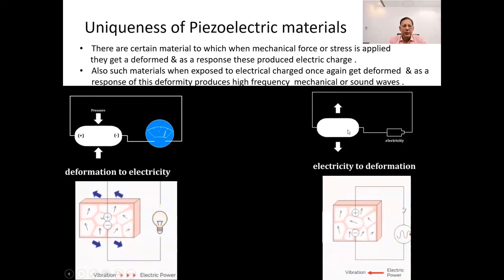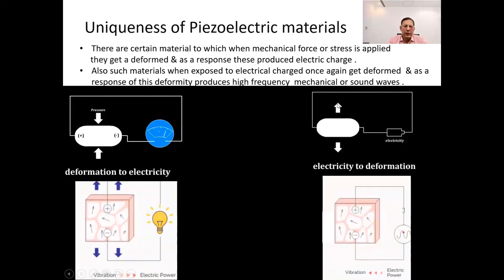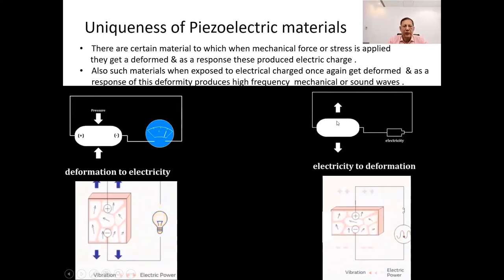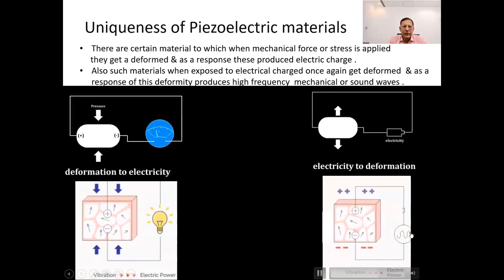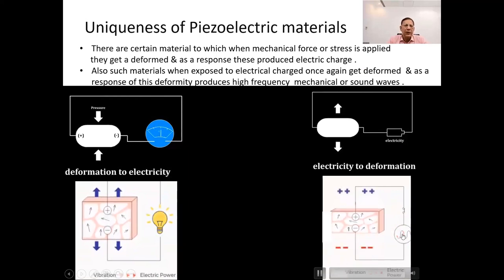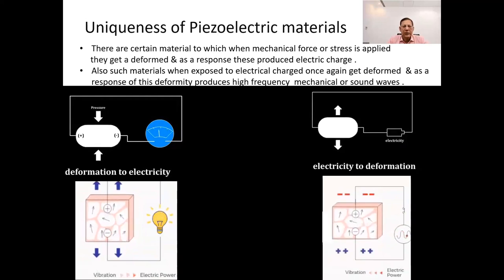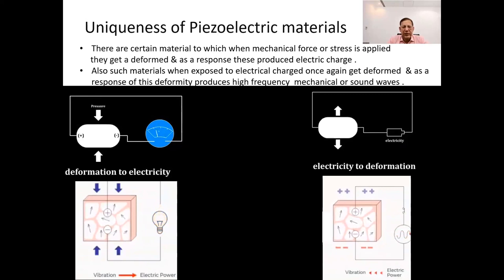They undergo deformation due to the voltage applied, and in return, they produce mechanical vibrations or sound waves. In essence, piezoelectric materials possess this remarkable ability to convert mechanical energy into electrical energy, and vice versa, making them invaluable in various applications, ranging from sensors and actuators to medical devices and beyond.